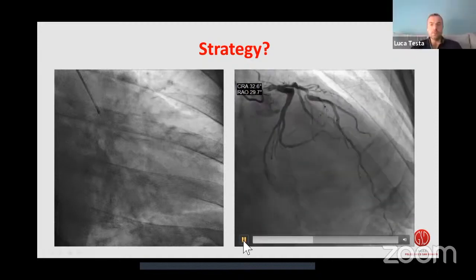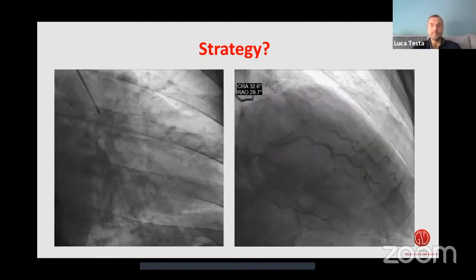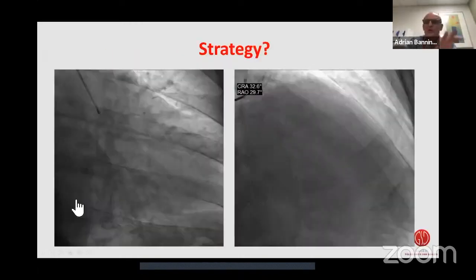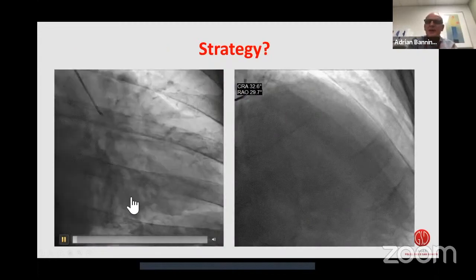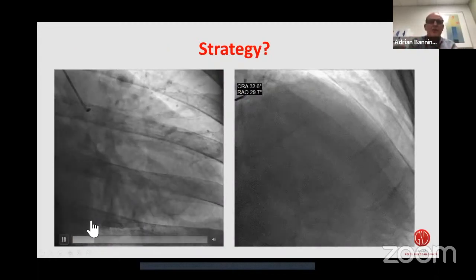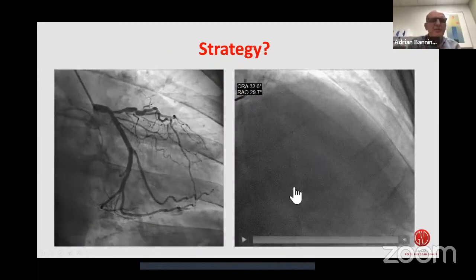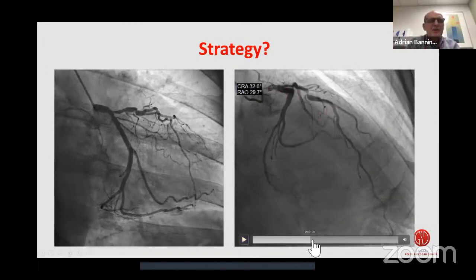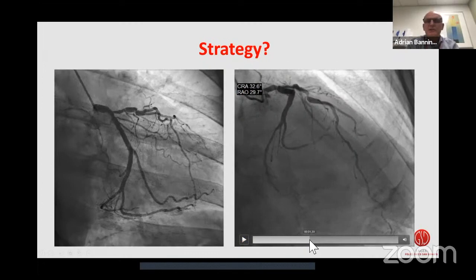I think you have to remember how much disease it takes to produce an appearance like that. It's easy for us to forget. There's an awful lot of atheroma around the ostium of the LAD there, which must inevitably involve the terminal left main. But I would agree with Chima. I think they're also trying to get a measure of what you think the size of the LAD should be. Imaging would certainly help you there. Yeah. But you're going to be moving quite a lot of plaque. But I think you may get away with a single stent crossover into LAD, I think.